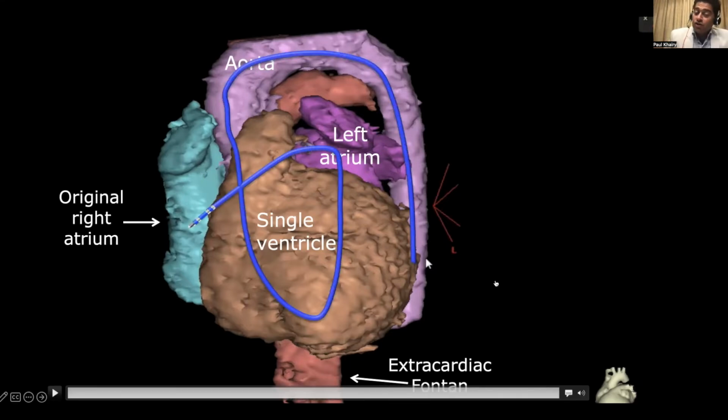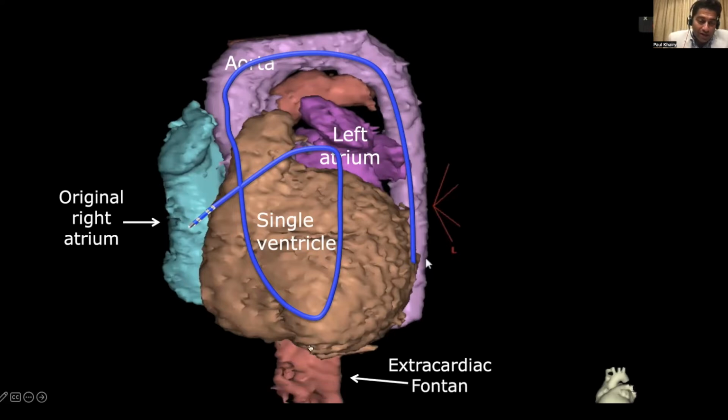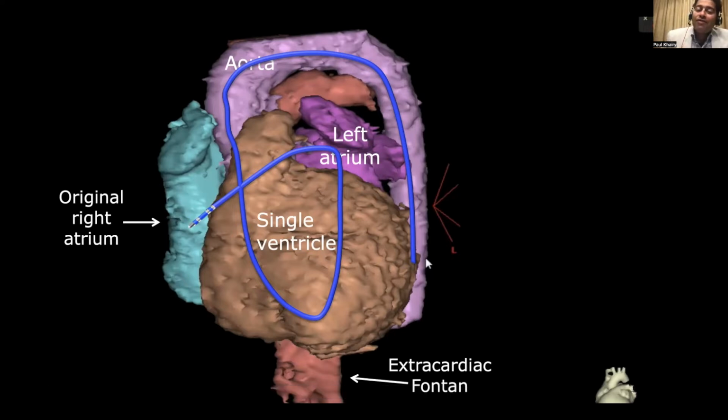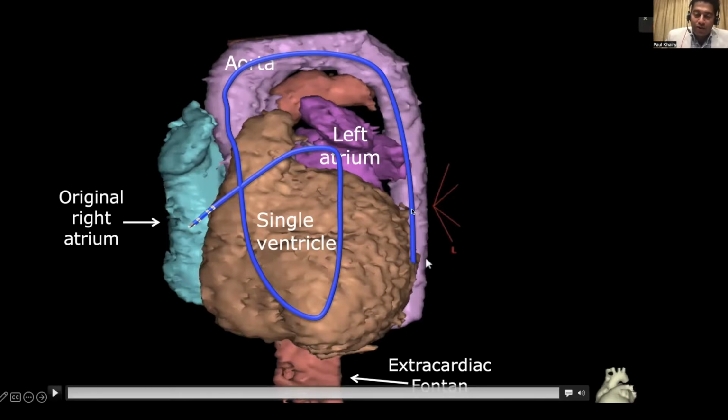And if you manage to do it with a manual catheter and get to that chamber of interest, well, even once you're there, you're going to have little control over catheter maneuverability. Now, you may be wondering, well, why would it be any different with magnetic navigation? Because after all, if you use a retrograde aortic approach, you're going to use that exact same trajectory.